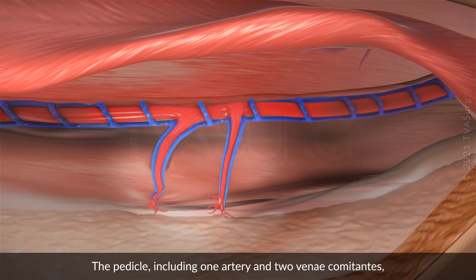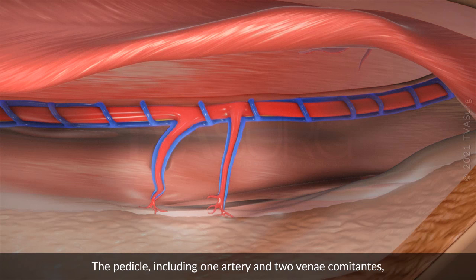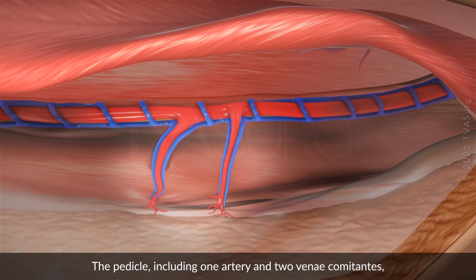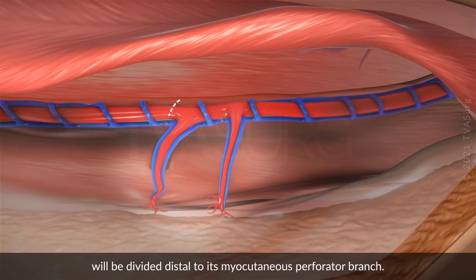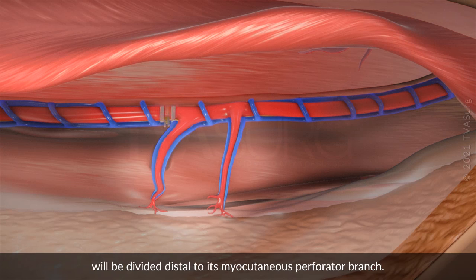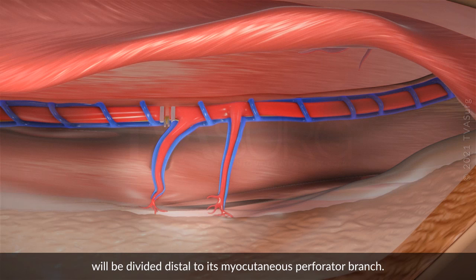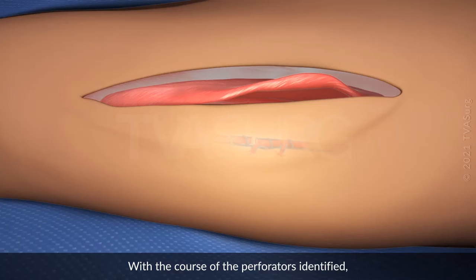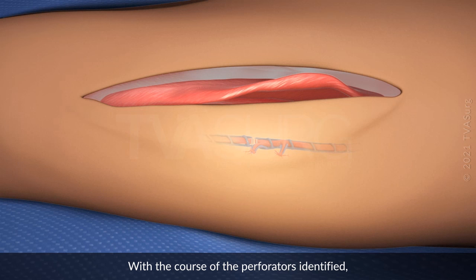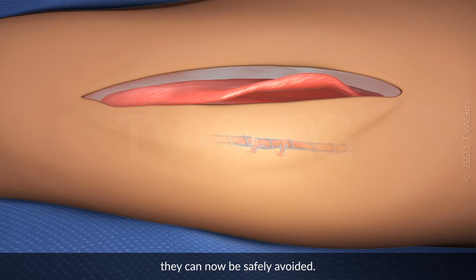The pedicle, including one artery and two venae comitantes, will be divided distal to its myocutaneous perforator branch. With the course of the perforators identified, they can now be safely avoided.